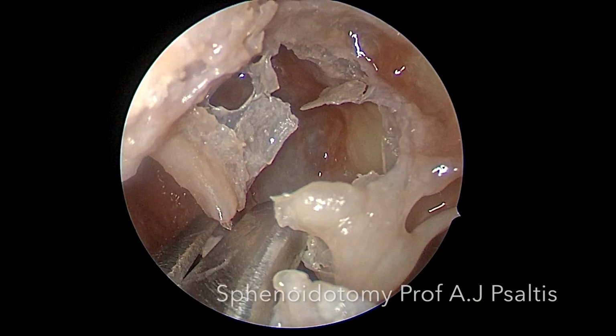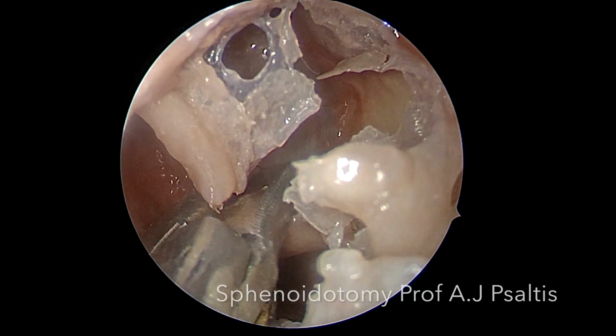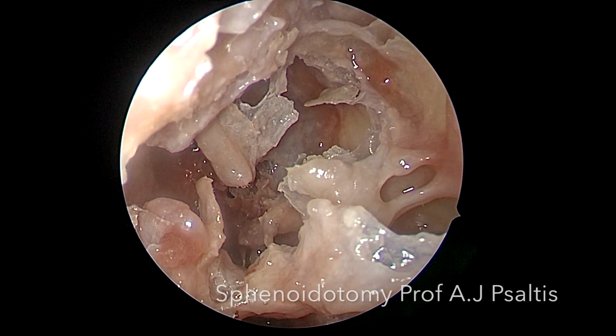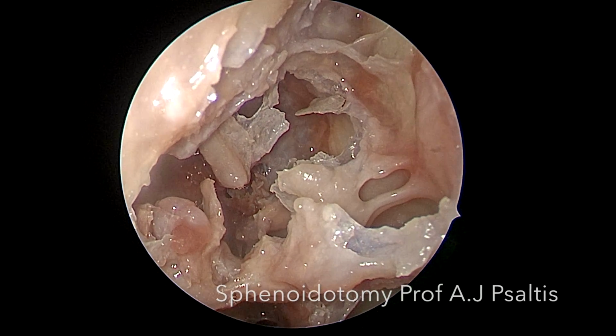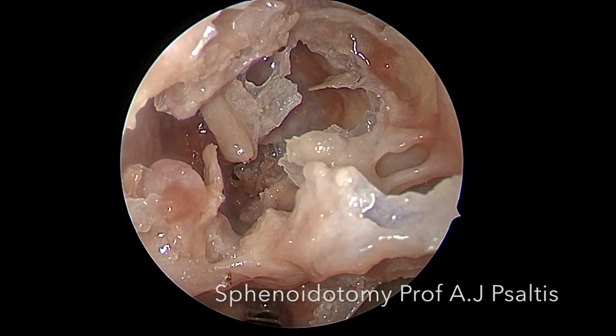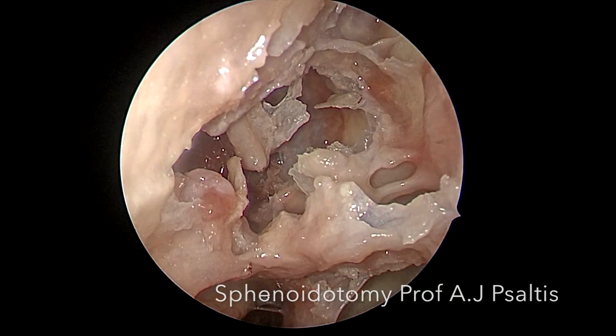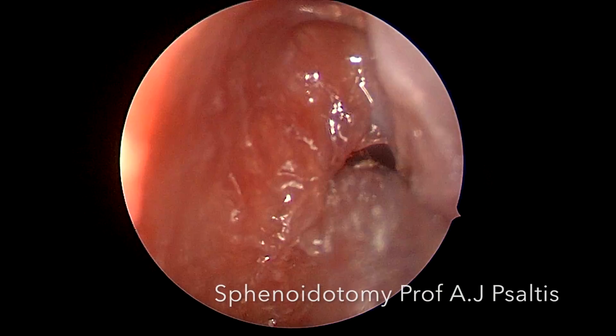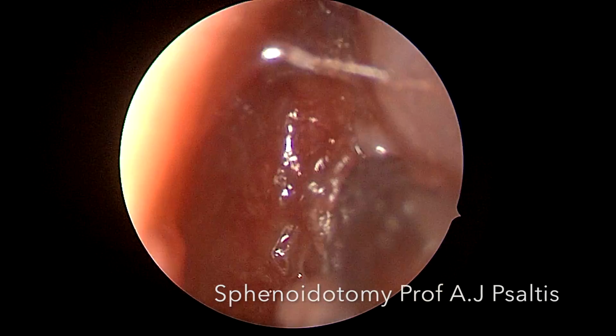We can now resect the inferior part of the superior turbinate at its insertion into the posterior face and lateral wall. Once this is performed, an instrument such as a kerrison or a 45 true cut can be used to widen the sphenoidotomy.